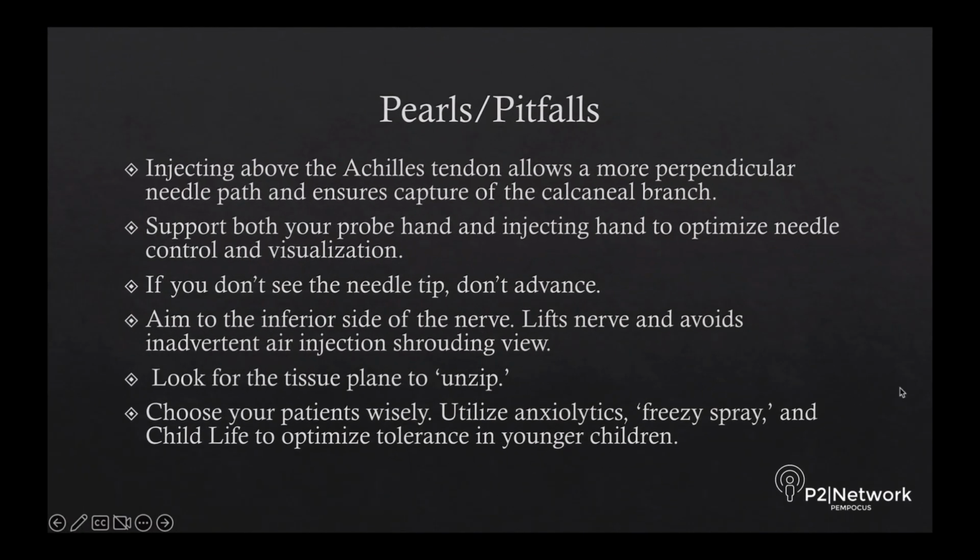Some pearls and pitfalls when performing this procedure. Remember to try to inject above the level of the Achilles tendon. This allows a more perpendicular needle path and ensures capture of the calcaneal branch of the PT nerve. Support both your probe hand and injecting hand to optimize needle control and visualization.